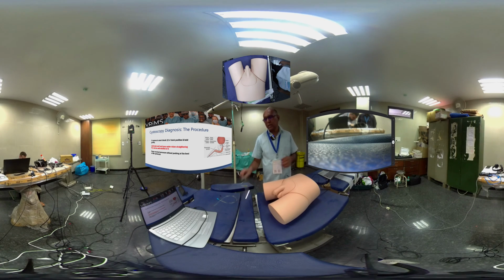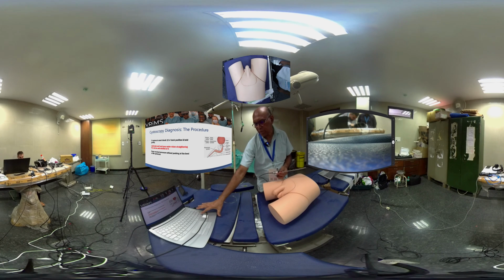And then here it is okay, but in conventional cystoscopy, especially when we have a camera, it is important to make sure that the 12 o'clock position is correct. So, generally we hold the camera fixed, and then you can move the scope to 9 o'clock or 3 o'clock position to see wherever you want to. But here that problem is not there, because it is fixed and the 12 o'clock position is up there. So, we can turn to look at the 9 o'clock position, or this way to look at the 3 o'clock position.